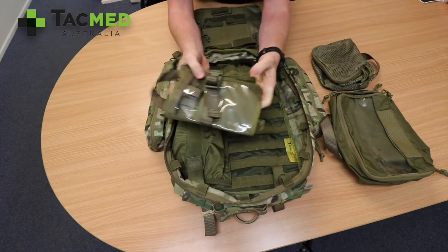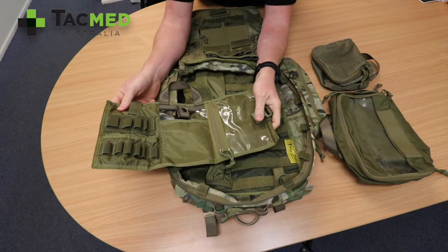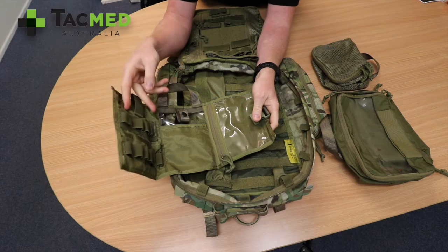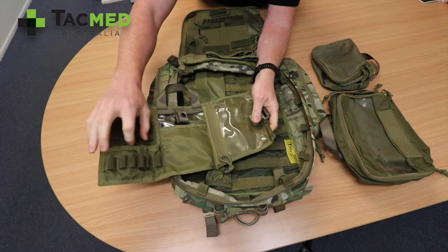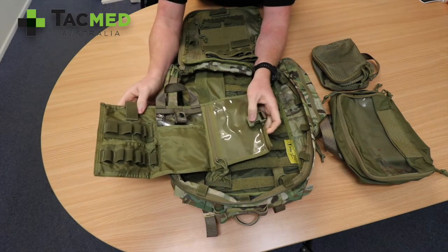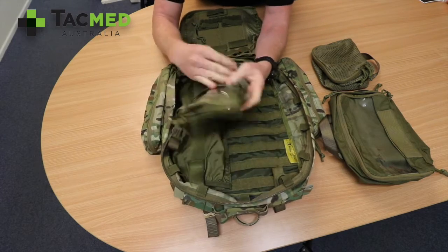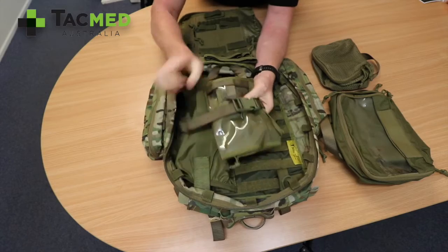It comes with a 500ml IV bag, and we've set this up with your tourniquet, alcohol swabs, bungs, tegaderm, and cannulas — so everything you need, including a giving set, will be in there. The bag attaches and tightens once you get the IV bag in place — it tightens really tight.